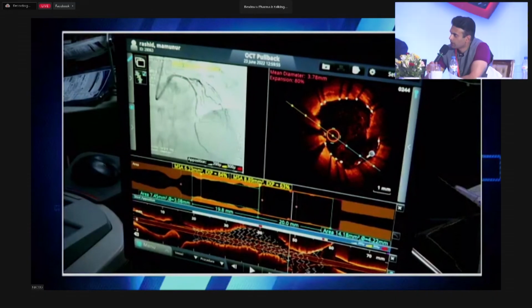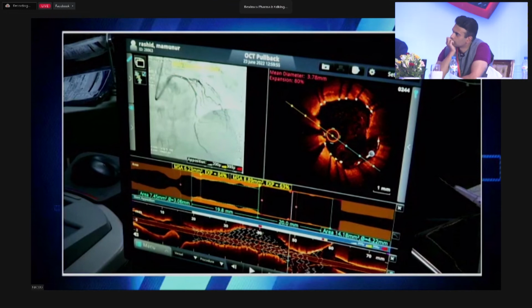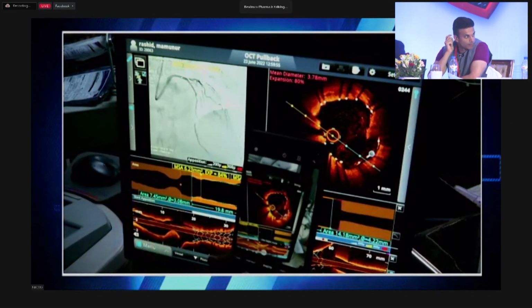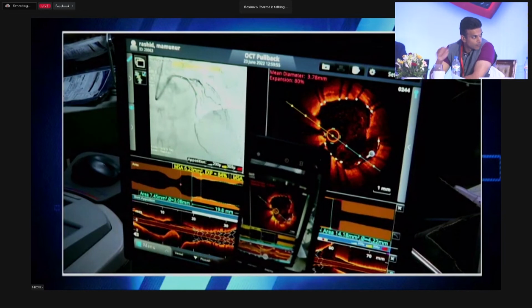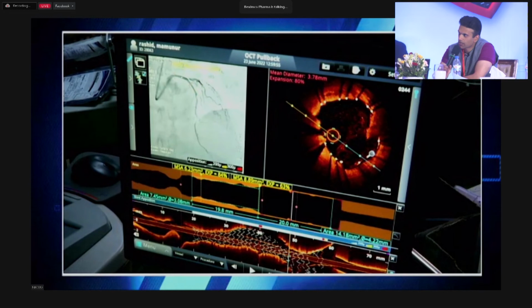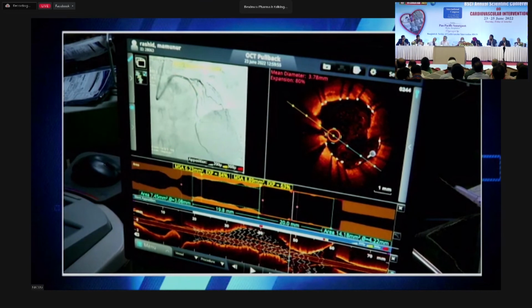And if you go about a millimeter over, it's even bigger. Sanjog, what do you think this is, which is protruding into the lumen and to the left? Is it a prolapse? That's what I was saying, I think that's plaque prolapse, right? But when we look at the IVUS that we had initially, this is the area where there was a lot of dropout in the wall, right? So this is a necrotic core, which is a setup for plaque prolapse. That's the plaque that splits.